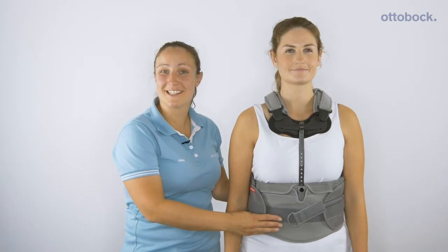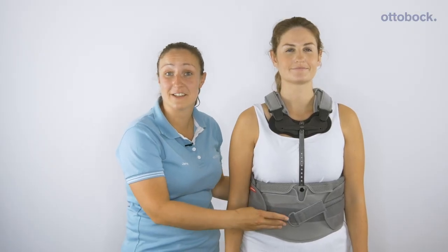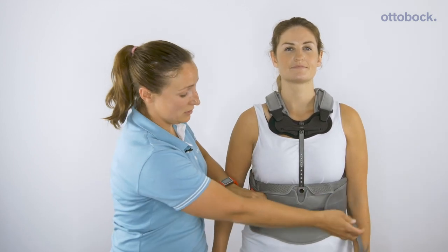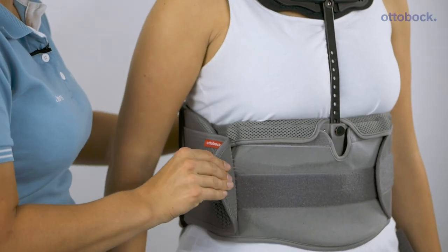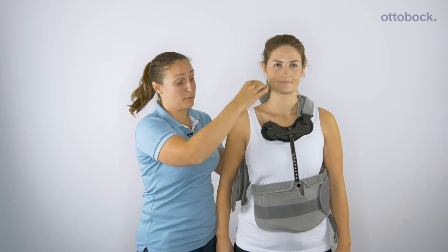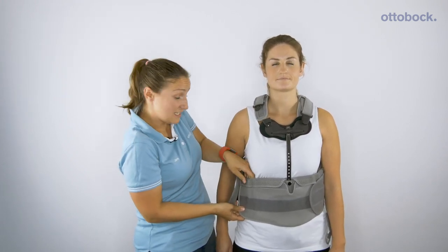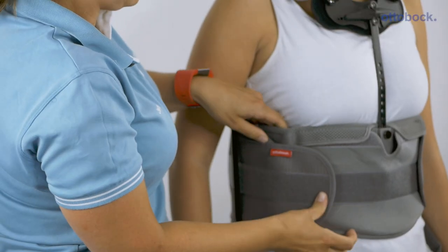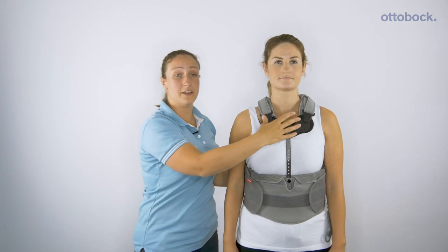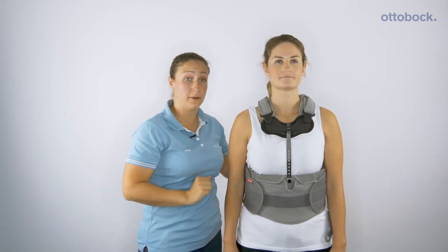All hospital policies differ in how TLSOs are fitted, however ideally you'd leave it in a clam position to easily take the brace on and off and ensure that the fit remains consistent. The sternal piece should fit two fingers below the collarbone.